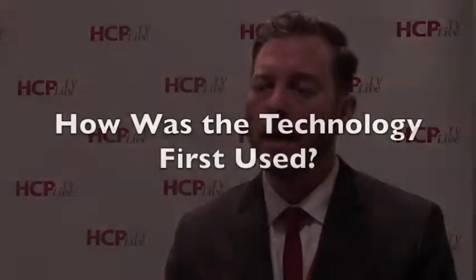After we perform that and evaluate the heart and make the medical decisions, we always want to take it back to the source image, where the model came from, and make sure that we can verify our understanding with that source image, so that we're not falling into those pitfalls. And that is really, for me, just by printing the heart out on some of these complex cases, and once my level of understanding is improved, I can then go back in and reformat the 3D image to demonstrate what I need to know. It's an amazing technology that we now have available to us, I think.